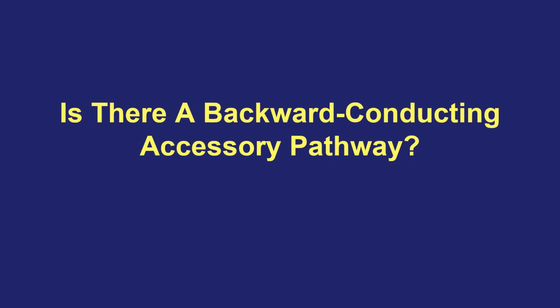There are many patients, though, who have an accessory pathway that conducts only in one direction. And that's the next question that we ask in the EP study. Is there a backward conducting accessory pathway?